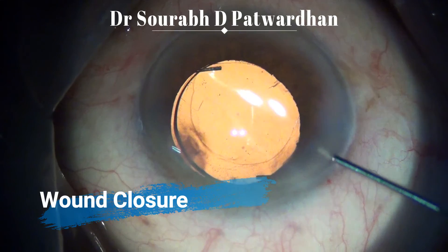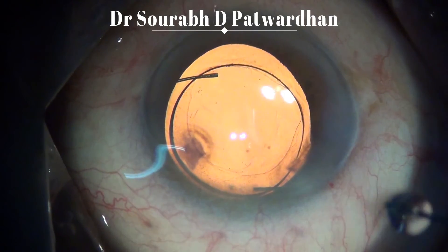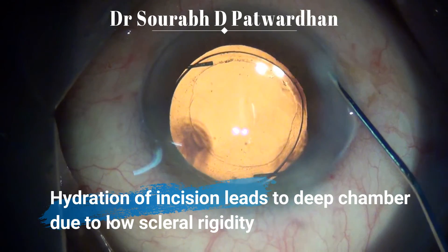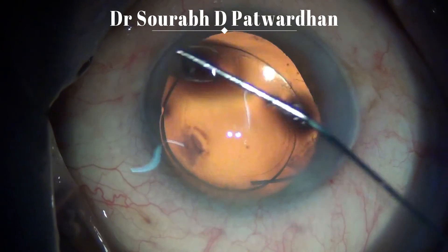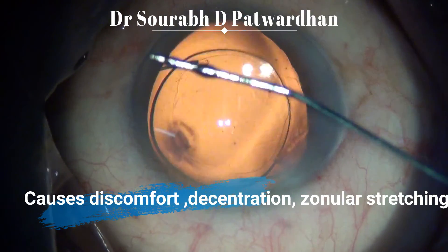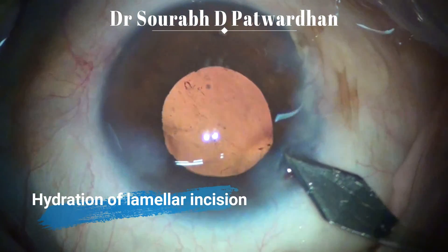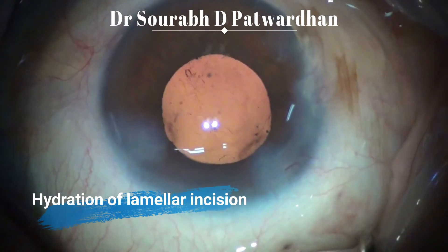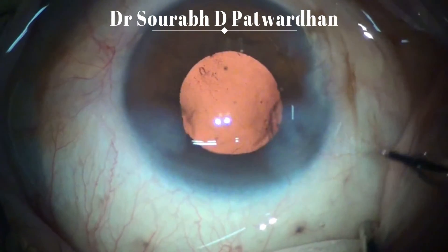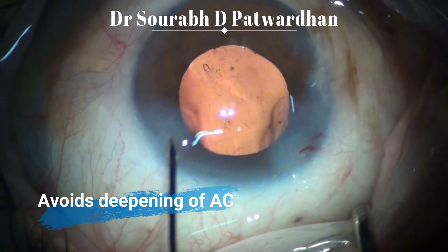For wound closure, because of low scleral rigidity, as you hydrate the wound the AC deepens and the lens-iris diaphragm is pushed backwards. This may lead to discomfort as well as decentration and zonular stretching. To avoid that, I sometimes use a sandwich technique where I make a lamellar incision over the main incision and then hydrate the lamellar incision. In this way, the wound is sealed without increasing IOP or deepening the anterior chamber, which also avoids decentration of the IOL.